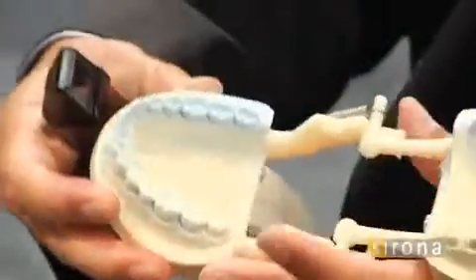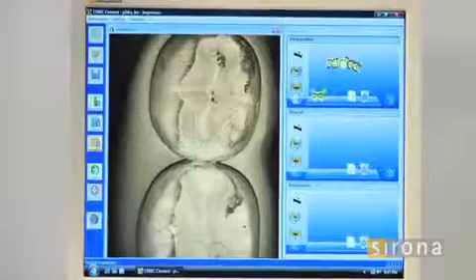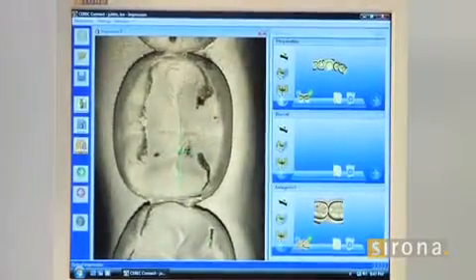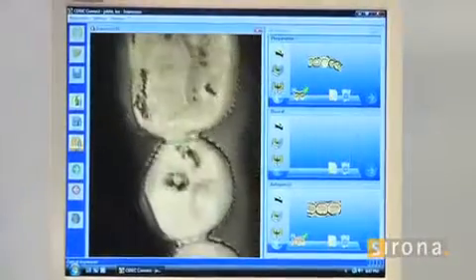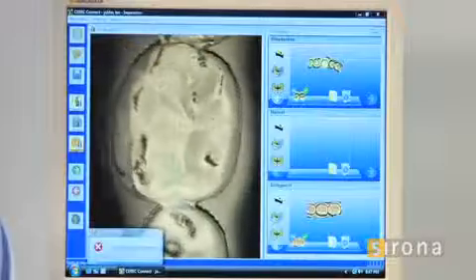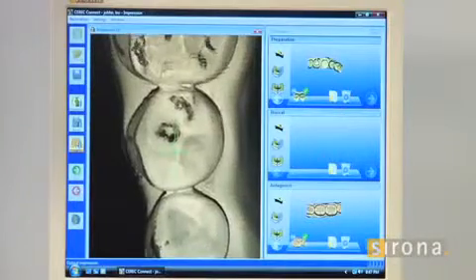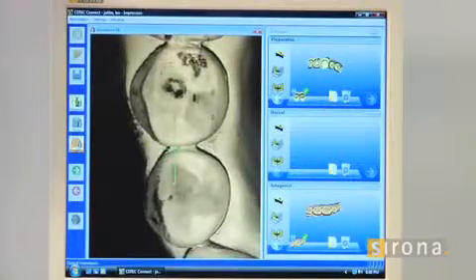So I've taken the area where I have my restorations. Now I'm going to move down and take my antagonist, or my opposing arch, using the same technology. One of the things I'm noticing is this camera actually does capture undercuts because you can shift the camera angle. Anything that you want to get — we were talking to some orthodontists here at the meeting about getting different areas possibly for retainers — all you have to do is roll to either side to gather what's below the height of contour of the tooth, because light does not bend.